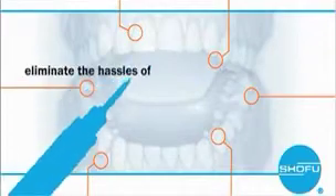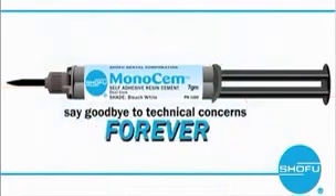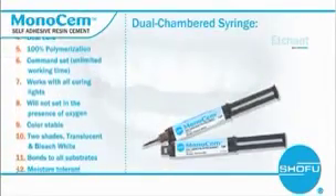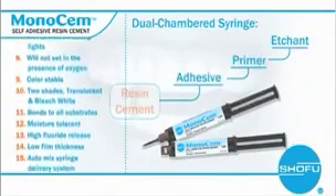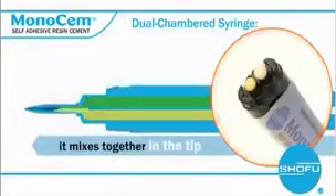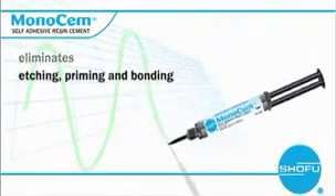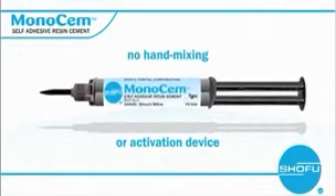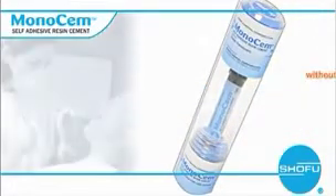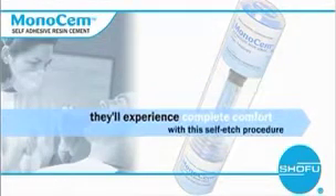Now you can eliminate the hassles of mixing, etching, and bonding, saying goodbye to technical concerns with resin cement forever with Shou Fu's new Monosem. Monosem comes in a dual-chambered syringe, combining the etchant primer and adhesive into one resin cement delivered in one convenient application. It mixes together in the tip while it's delivered to the restoration. It's one simple step that eliminates etching, priming, and bonding. There's no hand-mixing or activation device. Everything you need is available in one ideal application. Best of all, without acid etching, there's no sensitivity to your patient, so they'll experience complete comfort with this self-etch procedure.